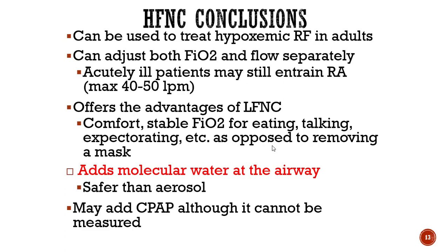Offers advantages over low flow nasal cannula. So obviously it's comfortable. You get a precise FiO2 for eating, talking, if you have secretions. All of these are advantages. And then again, if you're wearing a mask, you can't do those things. So that's why we like that high flow nasal cannula.